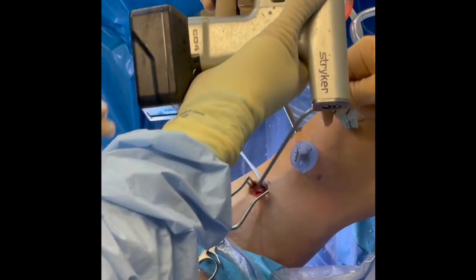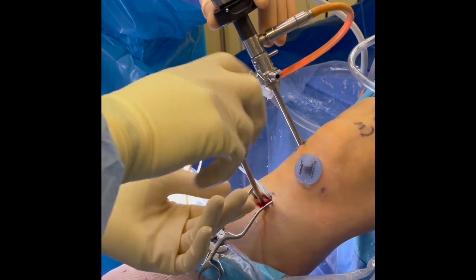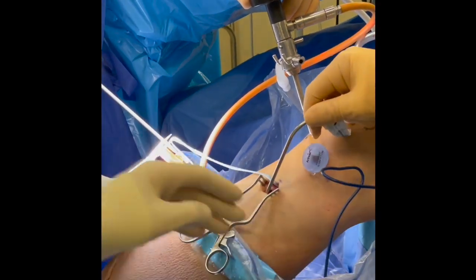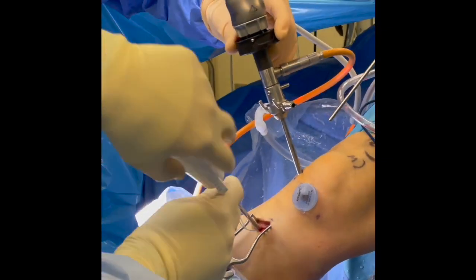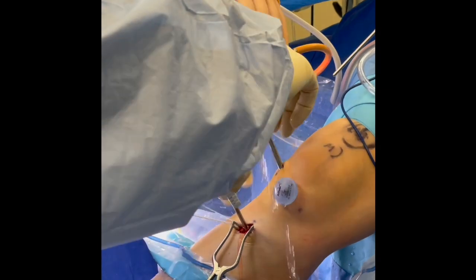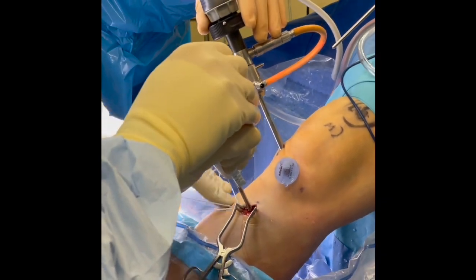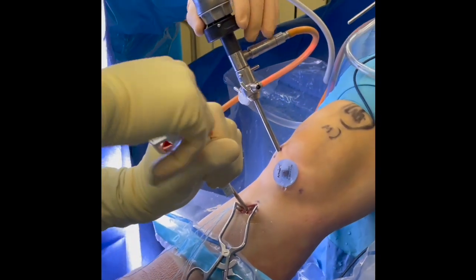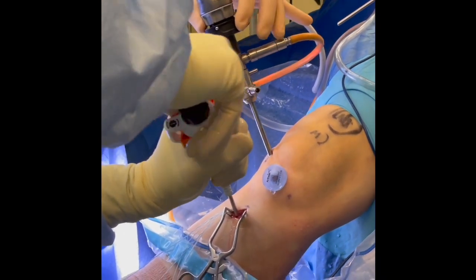To finish off the meniscal root fixation, we use a hard bone drill followed by the Smith & Nephew tap, so we can place the new helicoil anchor. Following this tap, we use a bovie to clear any soft tissues from this area. We load all four of the taped sutures onto the Smith & Nephew anchor. We turn off the fluid so we can visualize without too much extravasation, and then while holding it into the hole, we sequentially tension the meniscal root — working with the stitches closer to the root first, then those farther away, and then working our way back. This is very important to reduce tension and further move the meniscus closer to the root attachment. Following this, we use the black handle to engage the anchor and hold the sutures, and then finally we dunk the anchor using the orange handle.